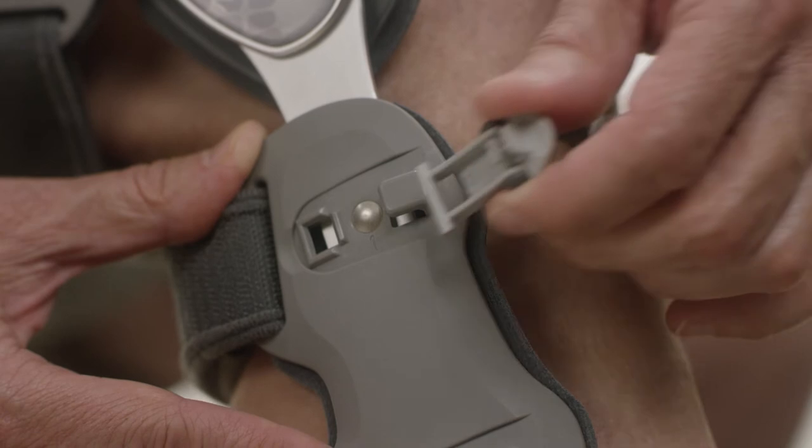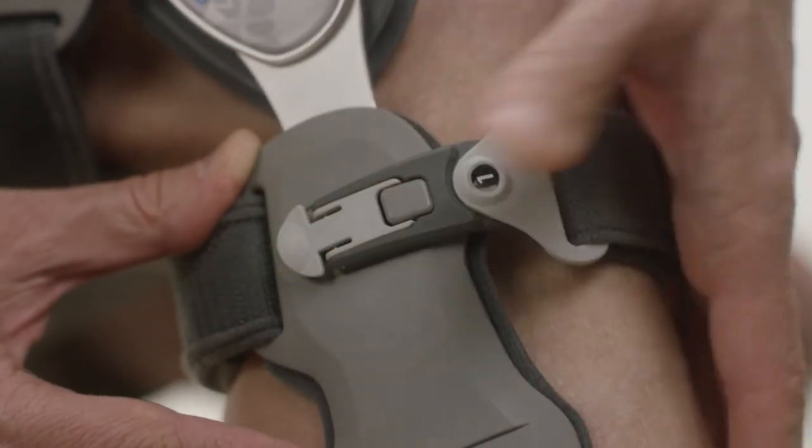Reattach the straps in sequence. Attach all buckles in sequence.